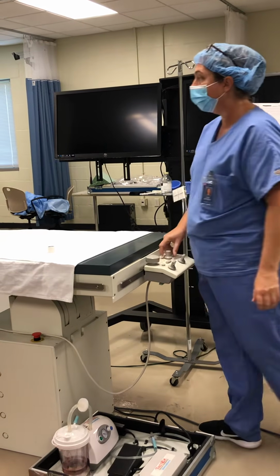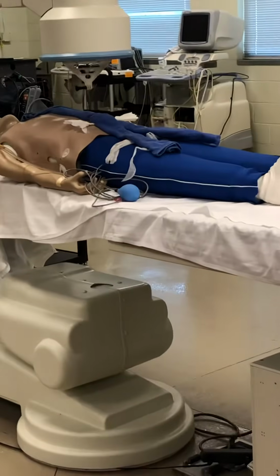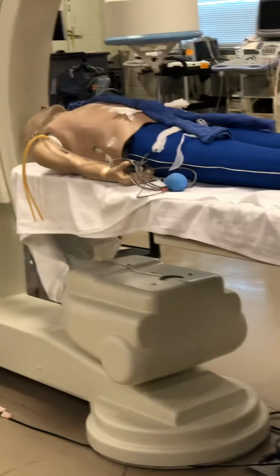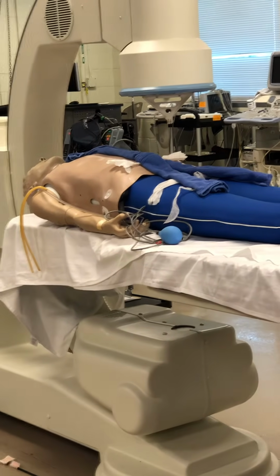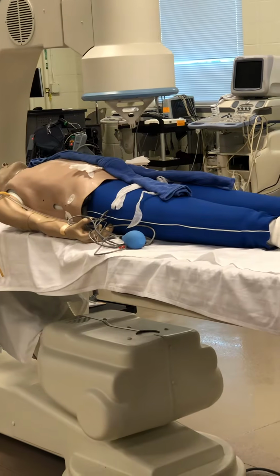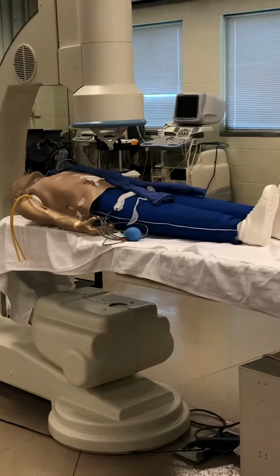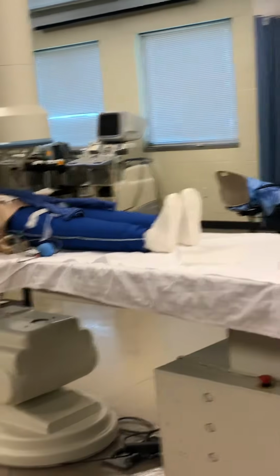And you can see how I'm a little off there, but when I go into that skew, I do have to move the patient over a little bit. For the left, straight AP, center up the renal, the whole renal artery, the kidney, so we can see everything. And for the abdominal, a little bit above, not a lot, but still straight AP.